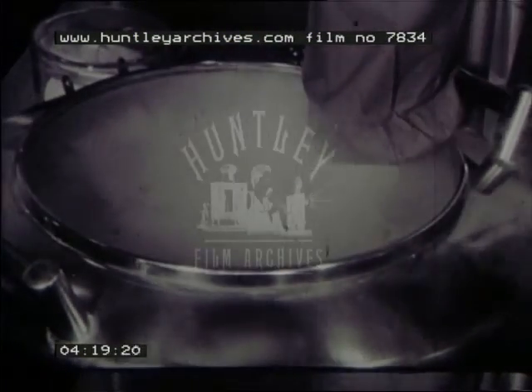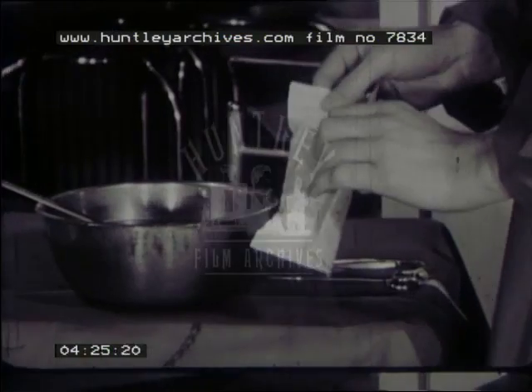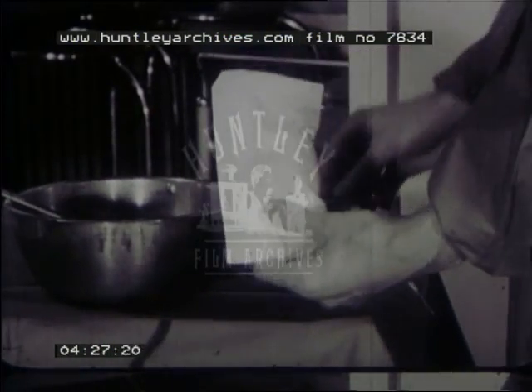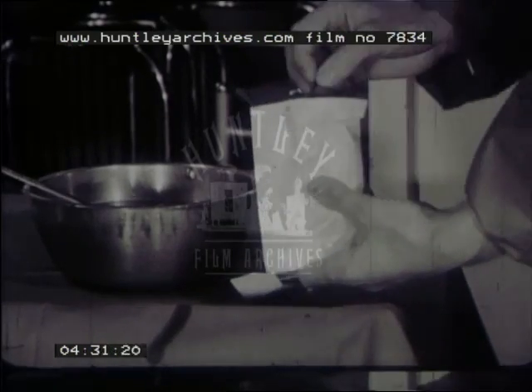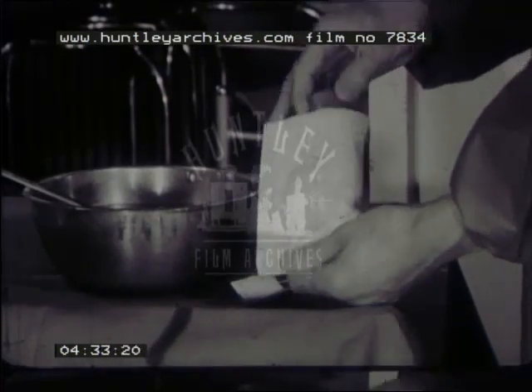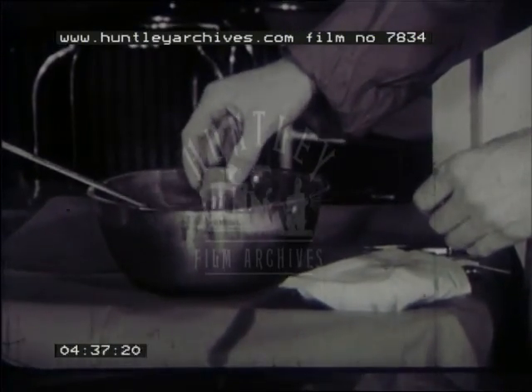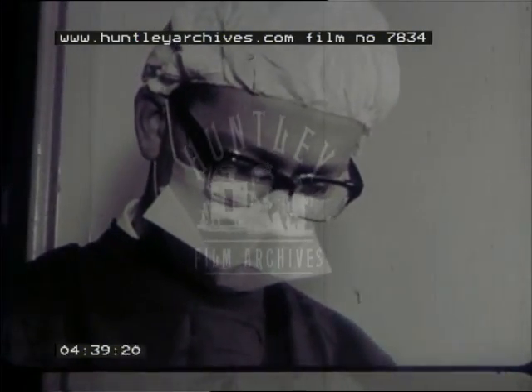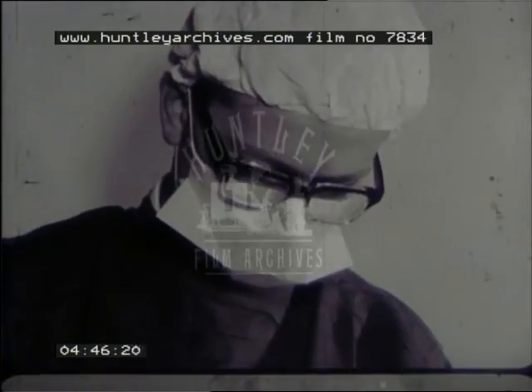On the day of the operation, the eyes are transferred to minus 79 degrees centigrade for slow recovery to that temperature. Immediately before the operation, the eyes are taken out of the carbon dioxide storage, the bag is opened, and the frozen specimen is placed and agitated in a water bath of about 65 degrees centigrade. As soon as all the ice attached to the cornea has disappeared, although the lens and vitreous are still frozen, the eye is handed over to the surgeon.